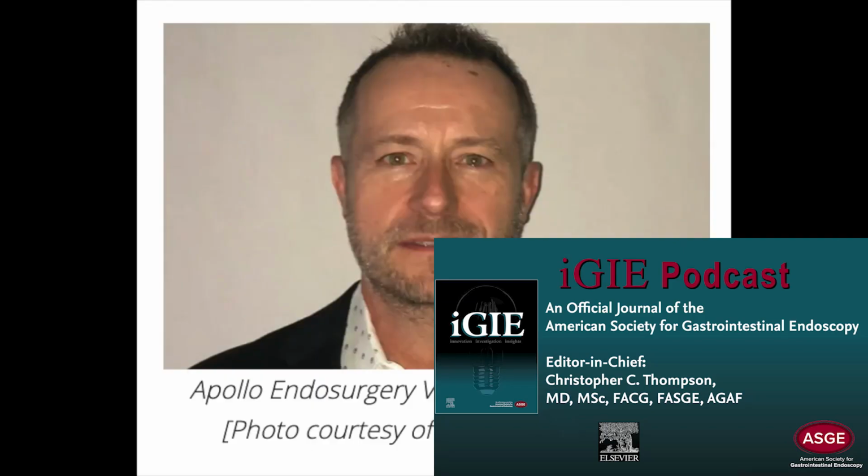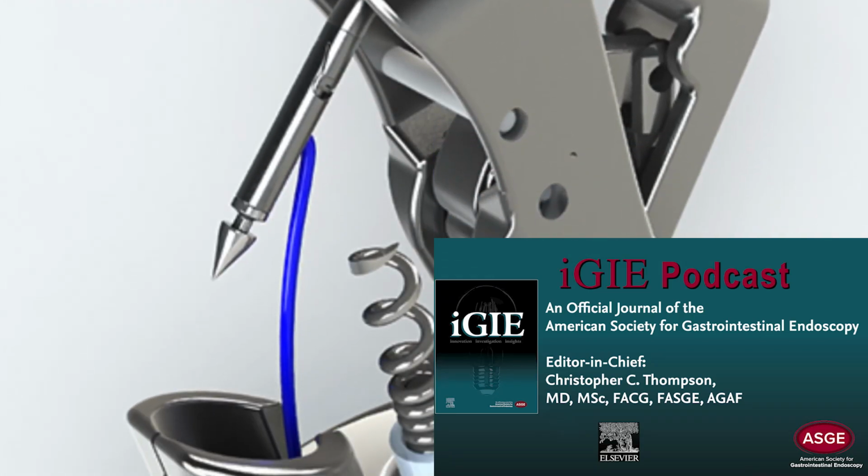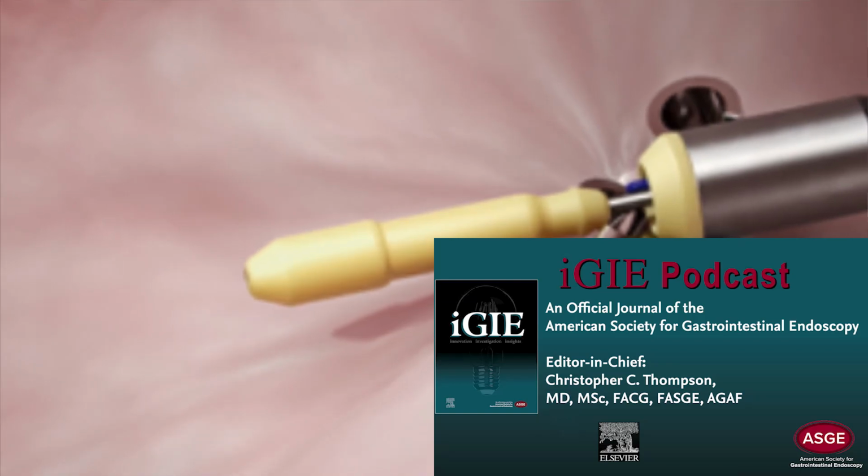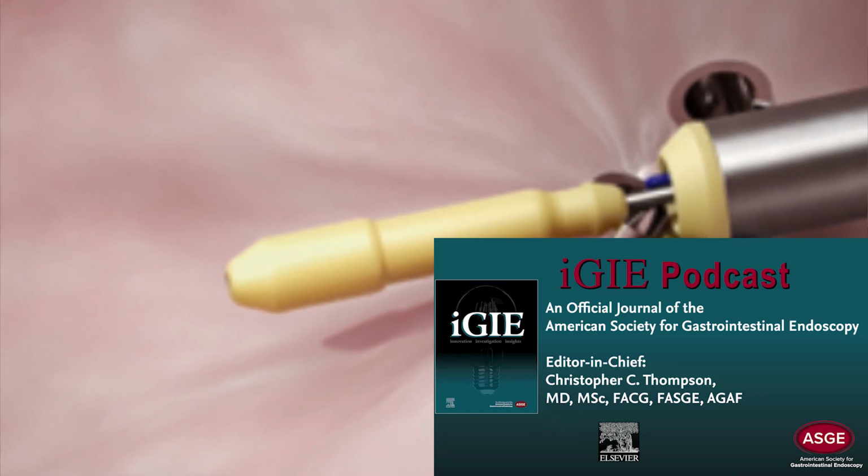Our primary device is a suturing device, so endoscopic suturing, the Overstitch device that many listeners will be familiar with. I'll talk a little bit, if we'd like, about the history around that, but it now has been on the market for about 10 years and has a wide range of applications in suturing in the GI tract. And then more recently, our X-Tac device, which is also a suturing closure device as well. And as I said, until recently, a publicly traded company and now a part of Boston Scientific.